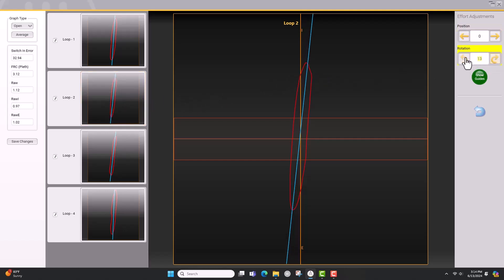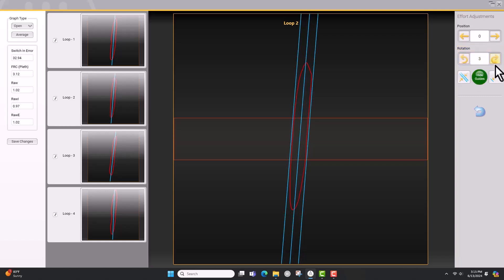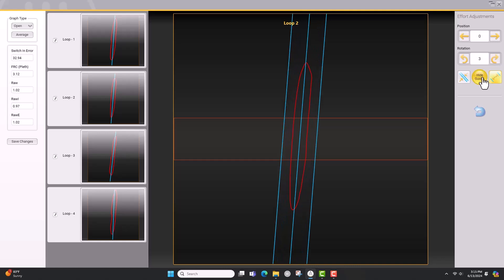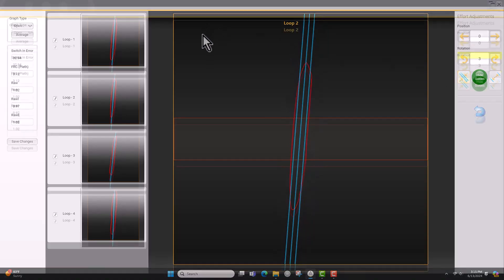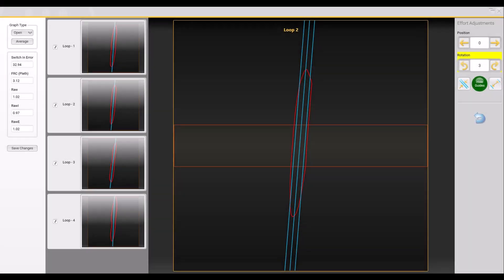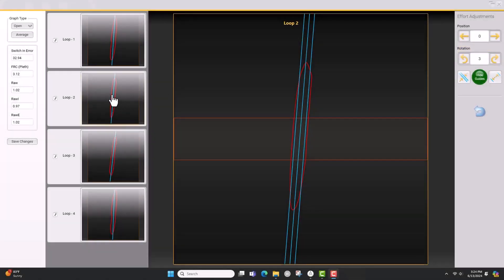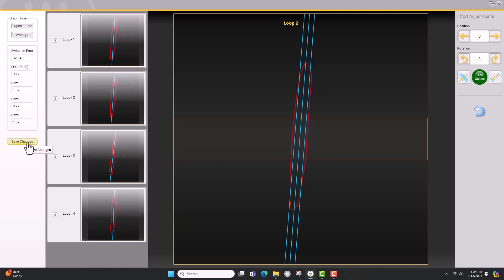You can also display guides to help with the angle adjustment. On the upper right, click on the Show Guides button. Three blue guides will be displayed and will rotate when you click on the Rotation button. The guides can be opened or closed using the button to the left or right of the Hide Guides button. Do this for all loops that need adjusting. Once you have completed any adjustments, you can deselect any loop from being averaged by removing the checkmark for that loop. When all changes are complete, click the Save Changes button.